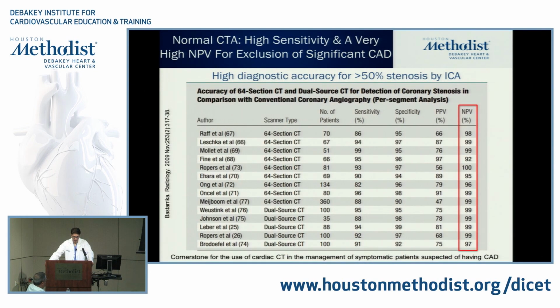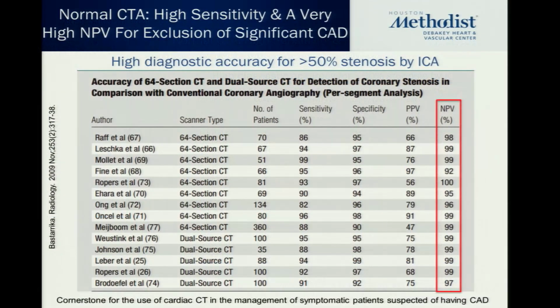Now, if you look at the ability to diagnose CAD compared to invasive angiography, this is now multiple studies shown on your screen. The data is consistent that the test has a very high negative predictive value. Meaning if we tell you that this patient does not have stenosis, you can be very confident that should your patient go to the cath lab, they will not find anything. And this is probably, of all the non-invasive tests, the most sensitive test we have to evaluate for coronary disease.